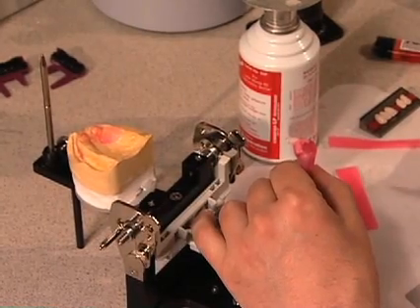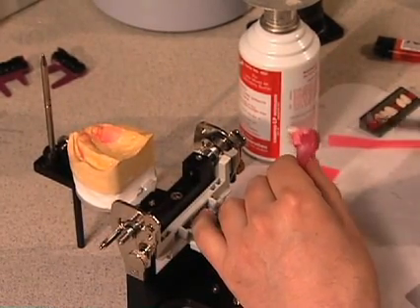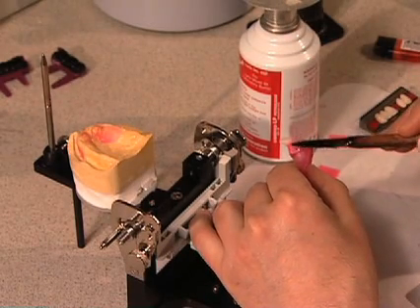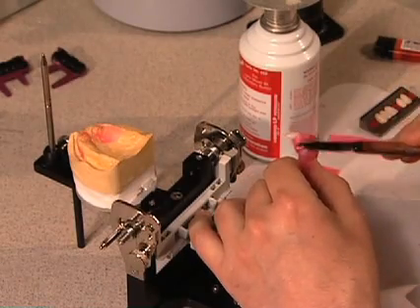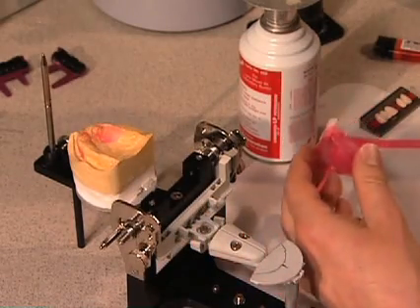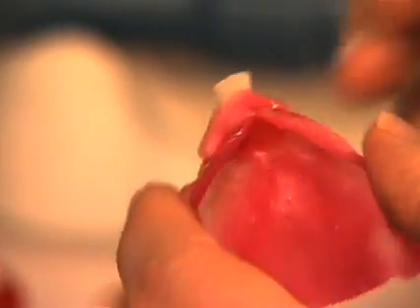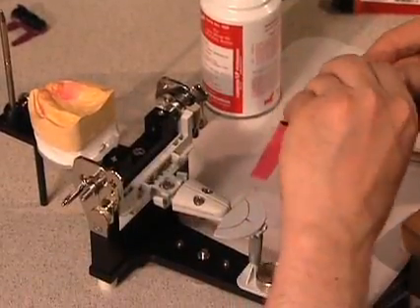Filling the flange with wax also helps to seal the tooth in position. Now we're going to set tooth number eight.